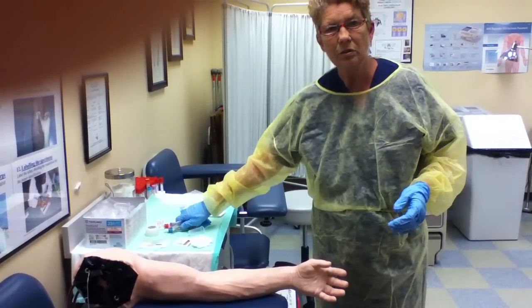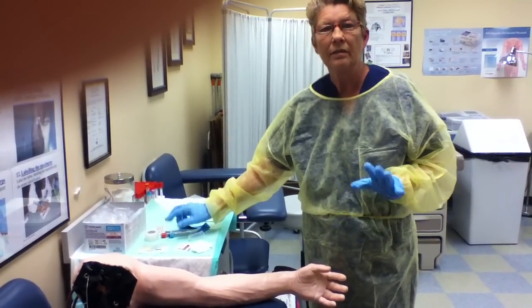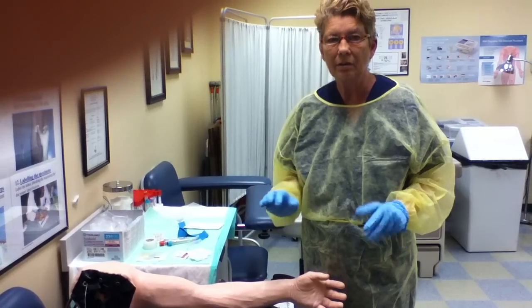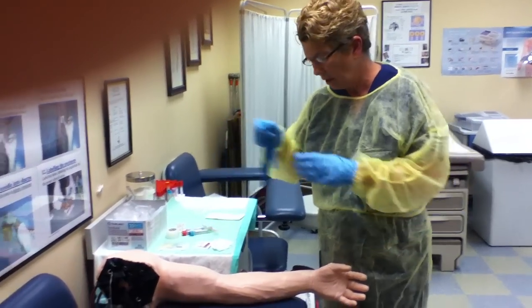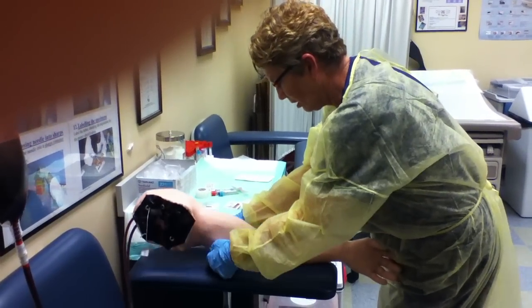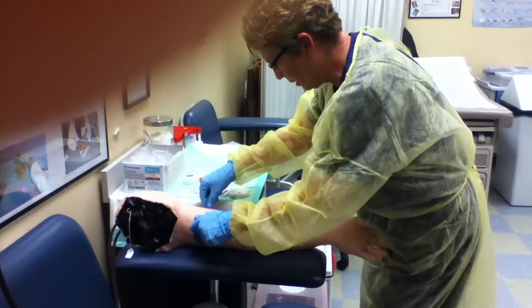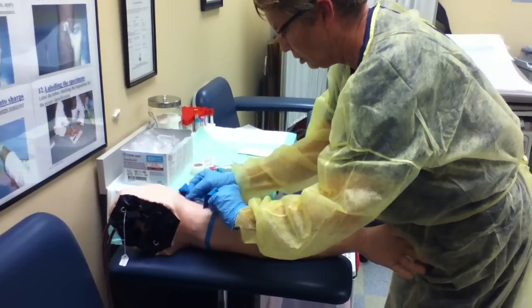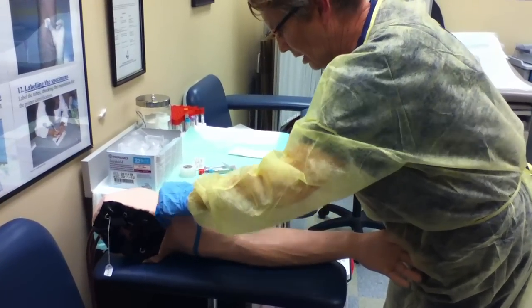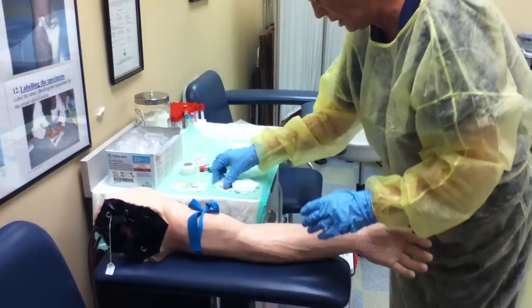The first thing you want to do is explain to your patient that you're going to be drawing three tubes of blood and they're going to feel a tiny venipuncture. You put the tourniquet approximately three inches above the antecubital space. You want to do this whole process in less than a minute if you can.